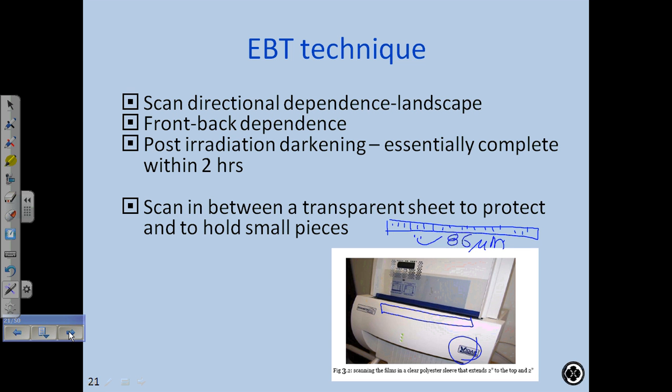Oh, by the way, our VIDAR scanner at Evanston Hospital broke down one time. We called VIDAR and found out what the quote was. The quote was something ridiculous, like $2,000 or $3,000 to get it fixed. So forget it. We called our biomedical engineering guys. We took this thing apart.